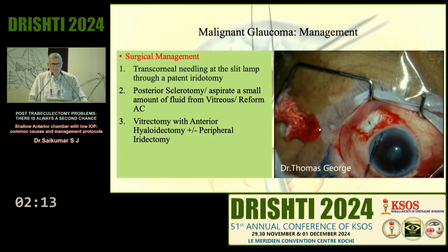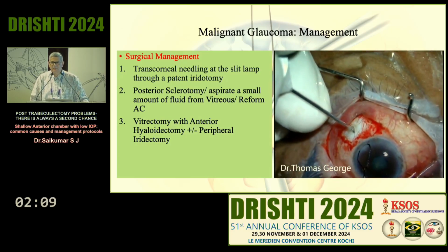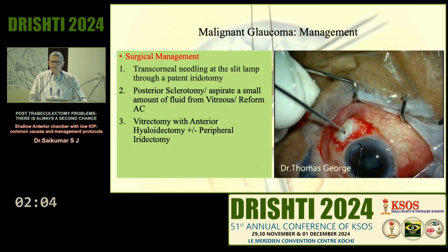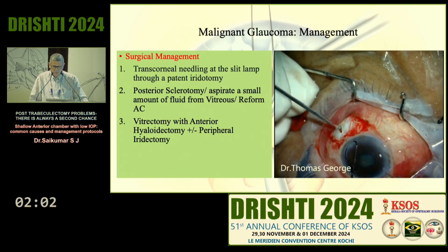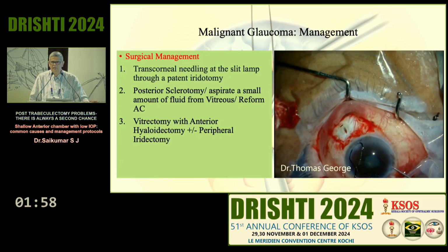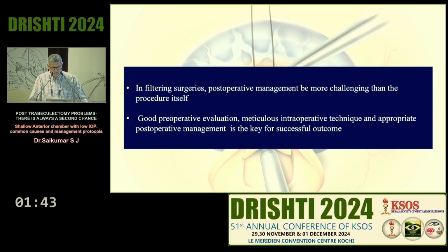This is something which I use intraoperatively, again not directly related to trabeculectomy, once in a while in intraoperative rocky hard eye syndrome during cataract surgery. When you feel that halfway through the surgery the chamber is totally shallow and the eyeball is very tight, you can just go in with an MVR, release some fluid without actively aspirating, and that relieves the pressure and helps you continue with surgery.